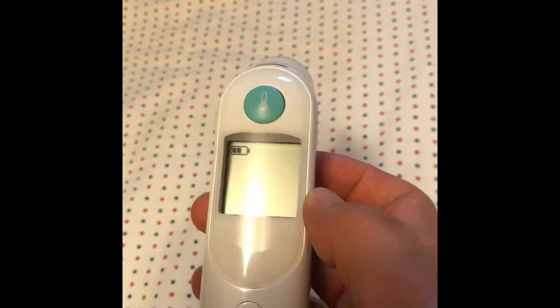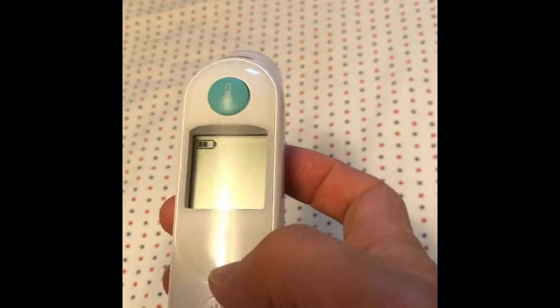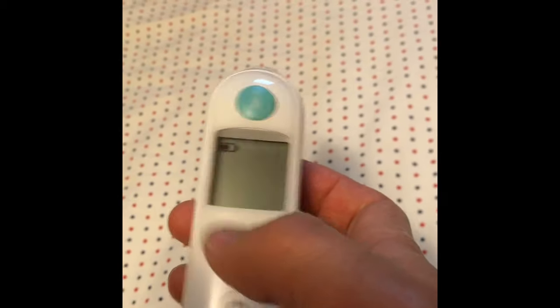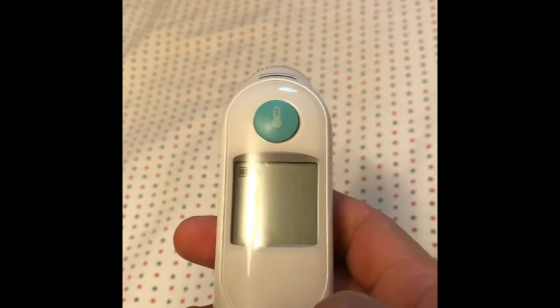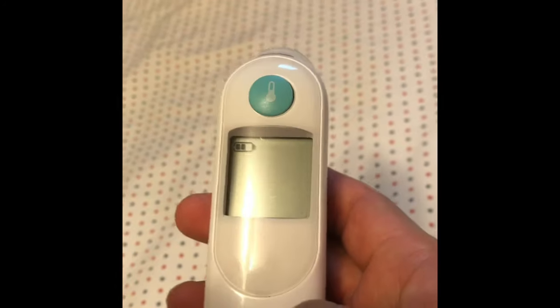It has charge in the battery, the probe is clean, and the cover here is brand new. But it keeps on showing this message. There's some problem — how can I solve this problem?